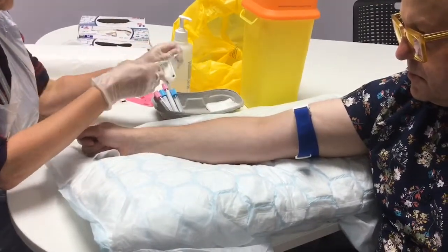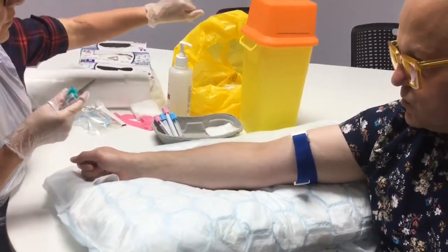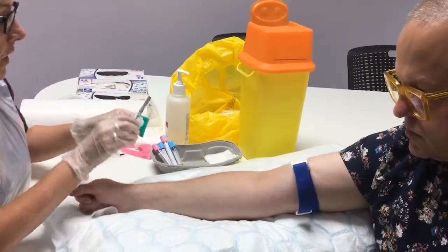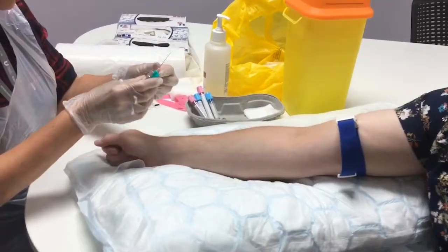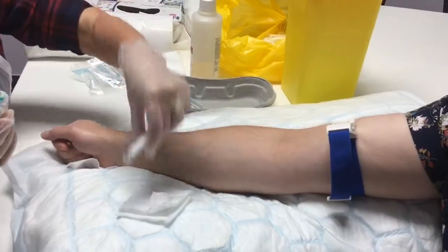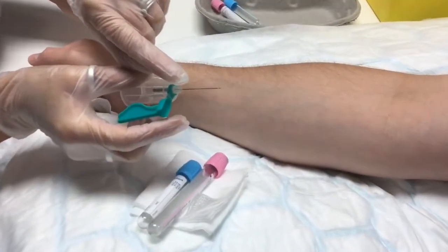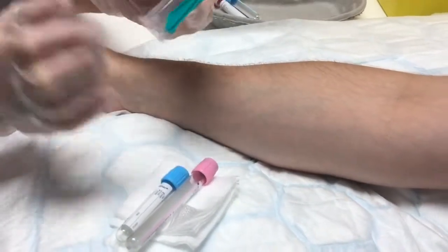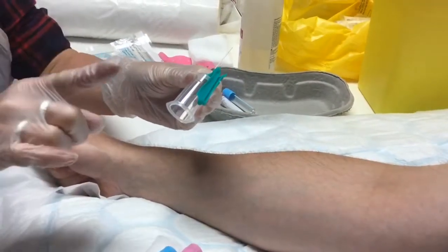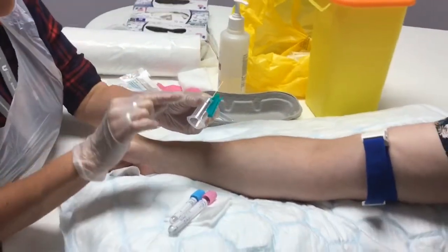I'm not going to touch the cleaned area again. Open your equipment — make sure you've got a bag to throw equipment away, and you must have a sharps box nearby. Check everything's in working order by unsheating your needle. Make sure your equipment is nearby, and have your bevel up so the little hole is facing upward. The grey part is where the bottles are pierced. It's important that you put the needle in first — don't attach the vacutainer container because it's already under vacuum.